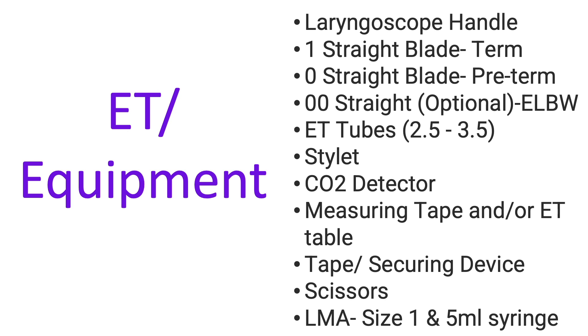For the endotracheal equipment, you need your laryngoscope handle. Check your batteries, make sure it's functioning, and that your battery is not expired. Blade size 1 is for term, 0 is for preterm, and 00 is optional for extremely low birth weights — these are straight blades or Miller blades. ET tube sizes available should be 2.5, 3, and 3.5. Think systematically: as the clinician intubates, most of us will require a stylet, so make sure the stylet is available.